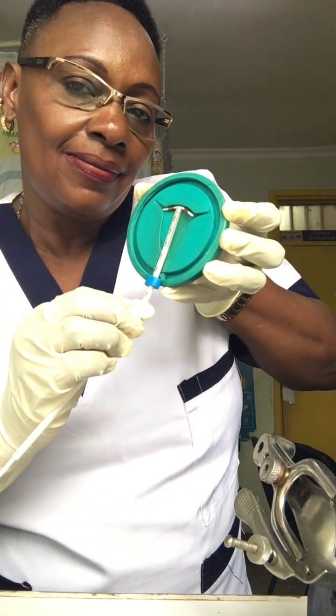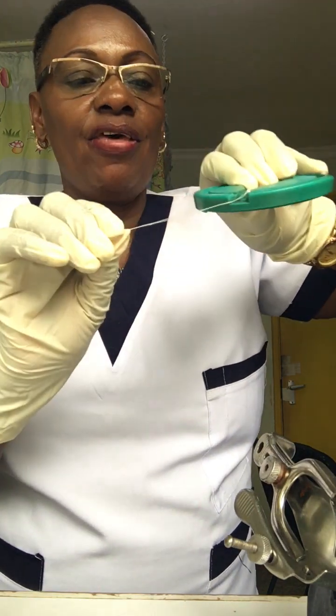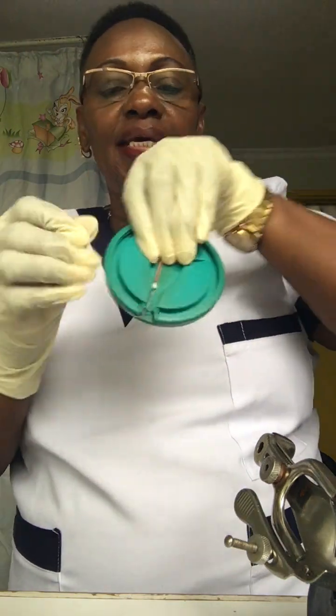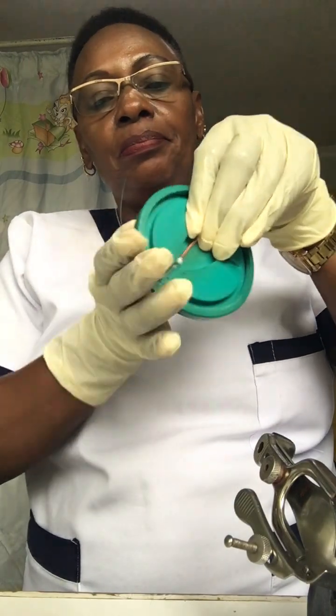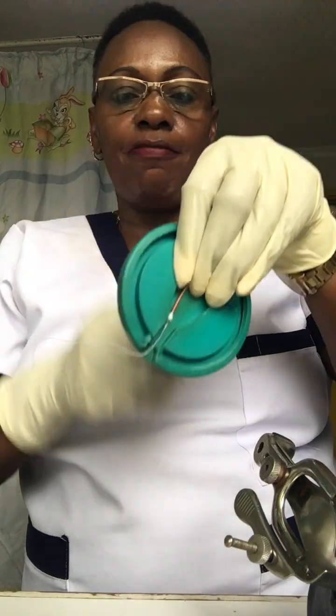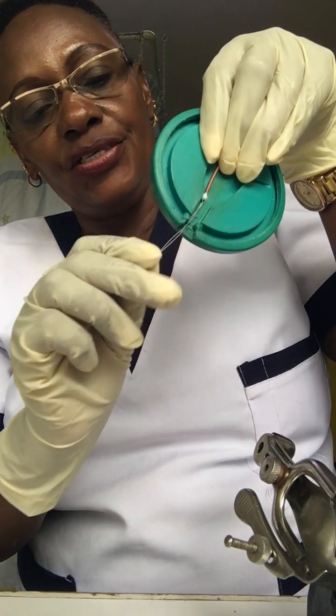Now the copper T is in situ. So we remove our introducer gently, like this. This one we discard. Now it has no use. These are the threads that are tucked in here. After a few days, they will have the same texture as the inner skin of the vaginal walls. If they are long, we trim a bit.